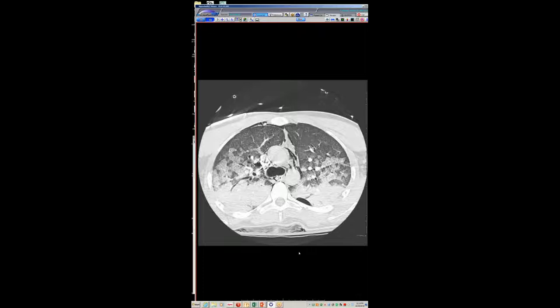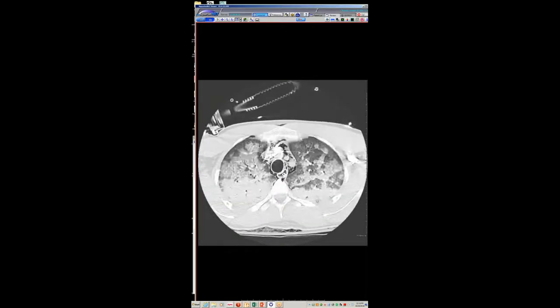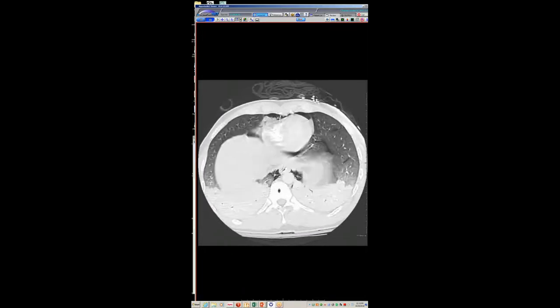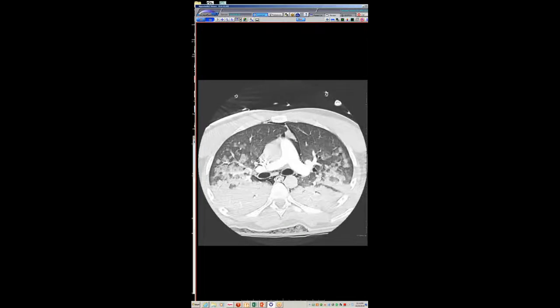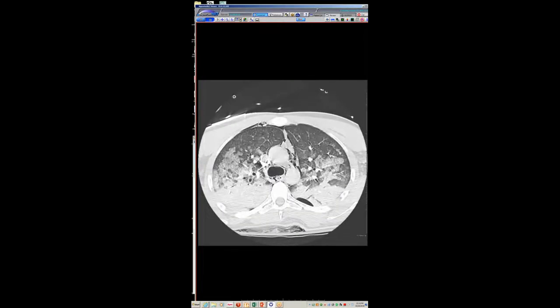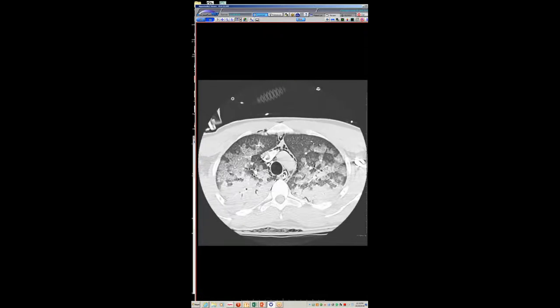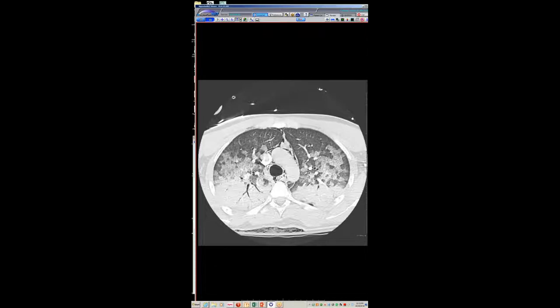I would just call this consistent with acute lung injury. The anterior-posterior gradient of opacity can also be explained by that alone — of course he could have aspirated. The opacity in the dependent lungs — if you image patients with acute lung injury and ARDS, one would see that pattern very commonly. It's ascribed to just the weight of the lung and atelectasis in the dependent lung. If you put the patient prone and ventilated them prone and did a CT, a lot of times that posterior lung would aerate quite nicely.